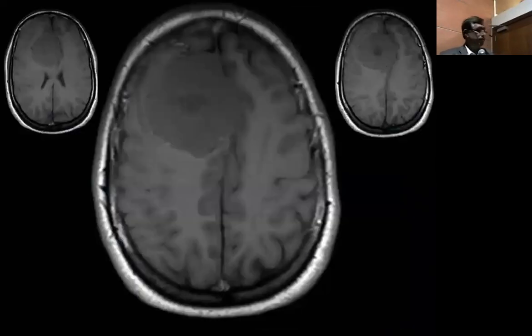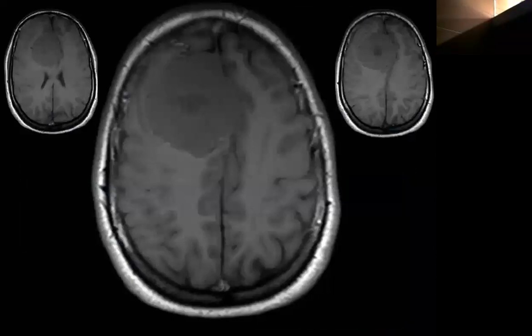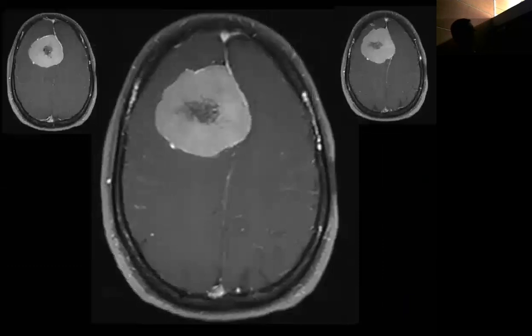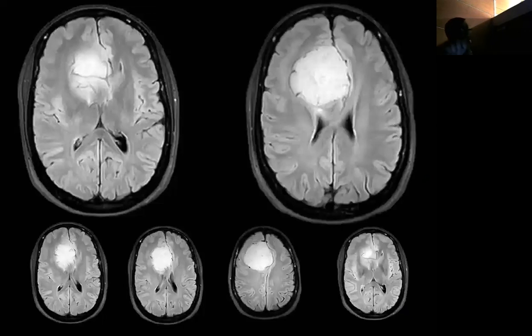This is MRI. Huge tumor. Stage 2. And you can see blood vessels are inside the tumor, which is the most important thing. Look at this. Blood vessels are inside the tumor. This is A2 on the left side. This is A2 on the right side. So the blood vessels are inside the tumor.